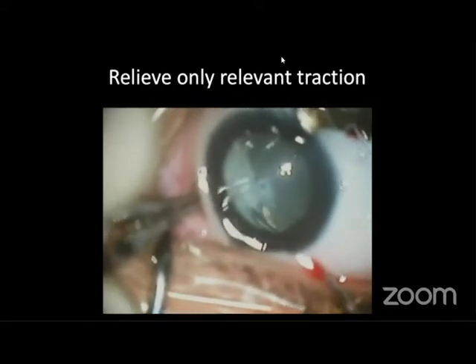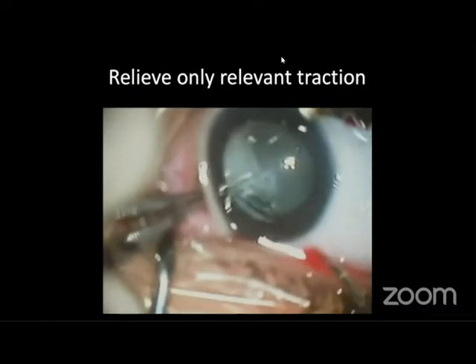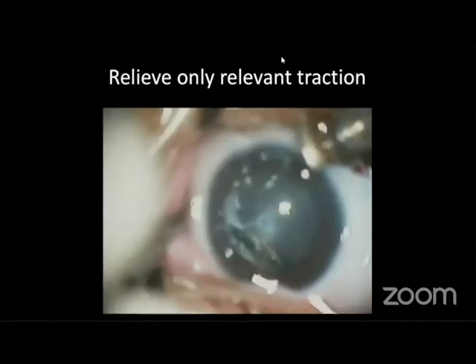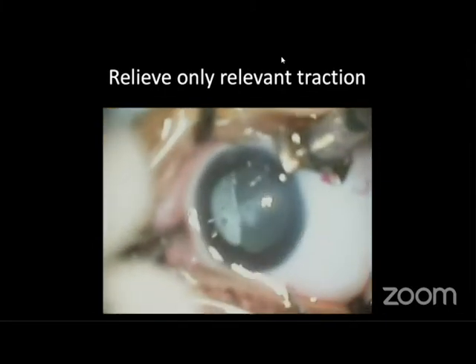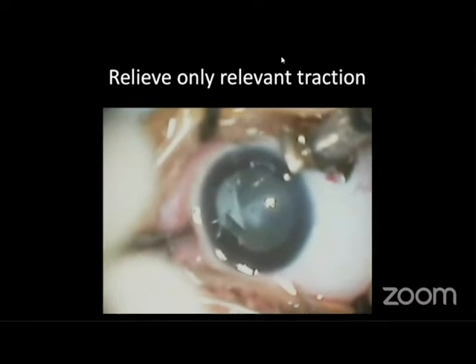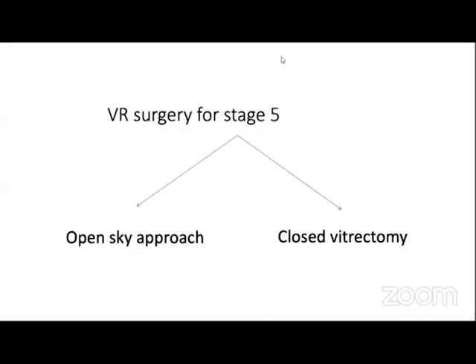You can see that the sclerotomy is placed in such a way that the scissors is able to access this area of traction retinal detachment, and the relevant traction from the ridge to the lens and from the ridge to the vitreous base is dissected with the scissors, without doing an extensive vitrectomy. So in select cases, this can be done as well.